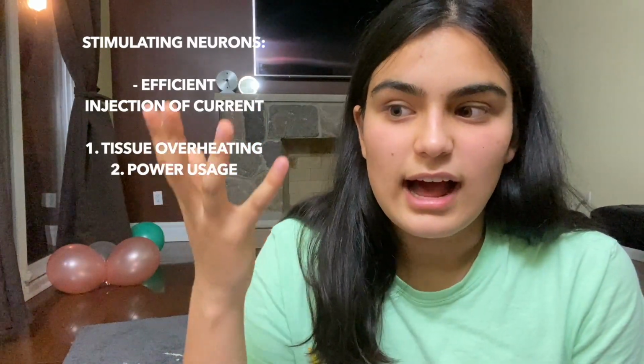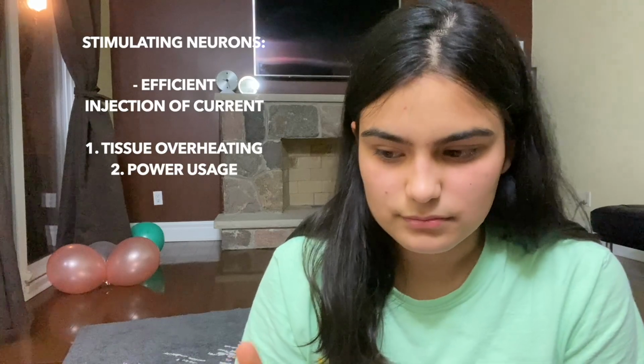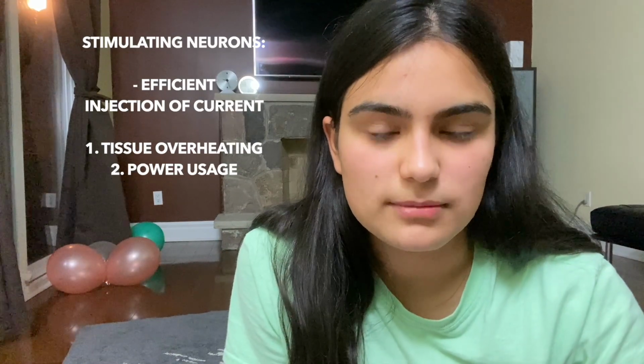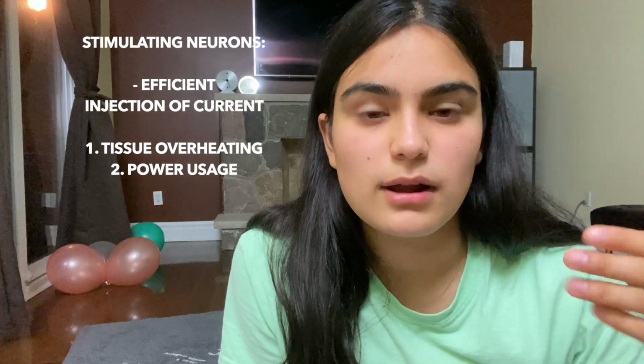When we're looking at stimulation, one of the most important constraints we have when stimulating neurons is we want to be efficiently allowing the current to get into the brain. And there's a few things here. First, tissue overheating. We cannot overheat the tissue in the brain. One of the biggest challenges with neural implants is you overheat the brain. And if the brain is overheated by 3 degrees Celsius, that's not allowed by FDA standards, I think. But to be honest, heating it even 1 degree Celsius, we don't know what will happen. We don't know the long-term implications. So it's super important to make sure we're not heating up the brain.